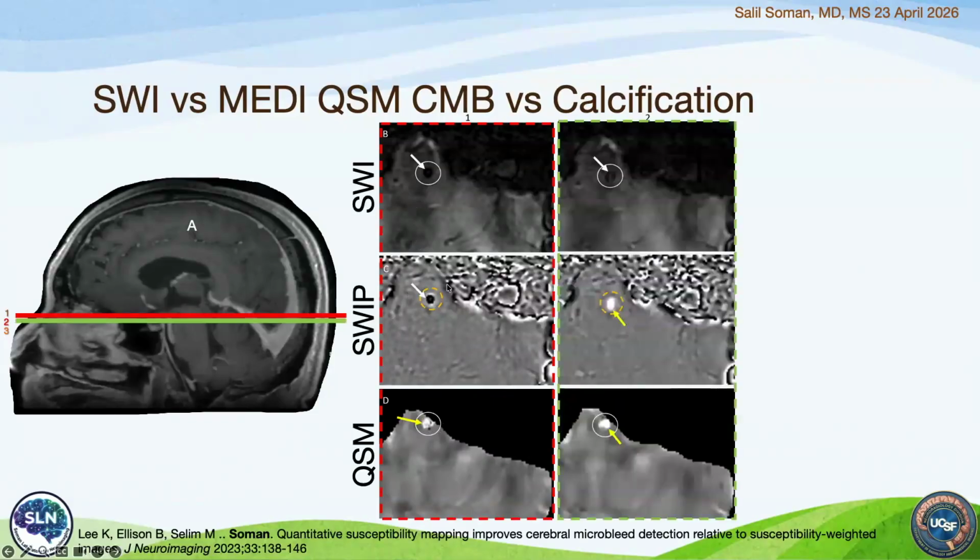But I'm going to do a second slice and say, okay, well, fine. Here now it's still dark, but now the phase is totally bright. I was like, what do I do with this? Clinically, if I didn't have the QSM, which stays consistently bright, but between these two, it's the same lesion. So this I would have to call non-diagnostic. We will usually in reports say probable microbleed, but you don't know.